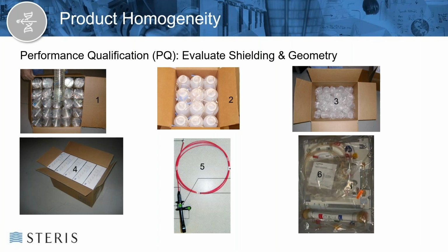Number 5, that example from the prior slide, it's certainly got some high mass areas. Might work fine for E-beam, but this is the sort of product that you definitely want to be a little bit more careful of in establishing the max and min dose, because the wrong type of configuration could provide you certainly too wide a dose distribution. That won't meet the customer specs.